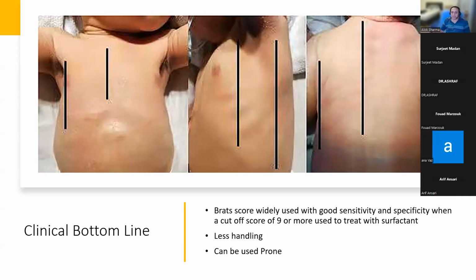I'm giving you a simple case that I've had recently. A baby born at 25 weeks who had surfactant has a beautiful lung ultrasound. On day 3, this baby goes into 30% FiO2, then 60% FiO2 by lunchtime at about 70 hours of age. A repeat ultrasound shows a right-sided pneumonic consolidation, right upper lobe, with a fractal sign. I do a CRP, it's 10.